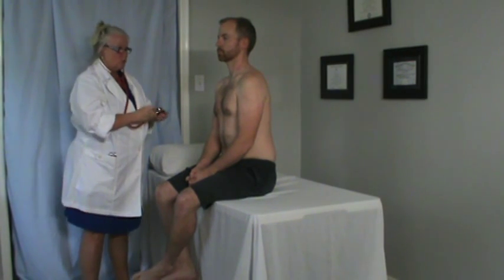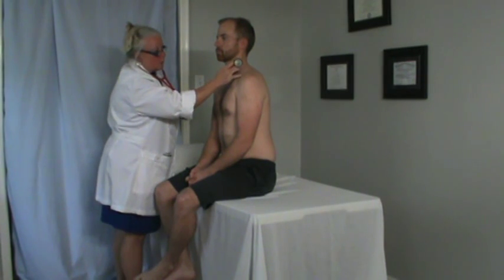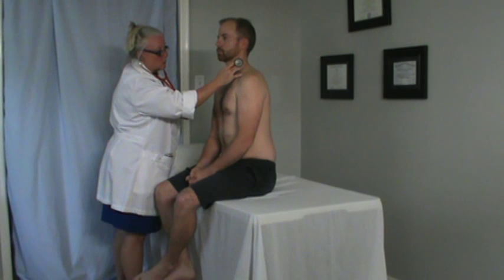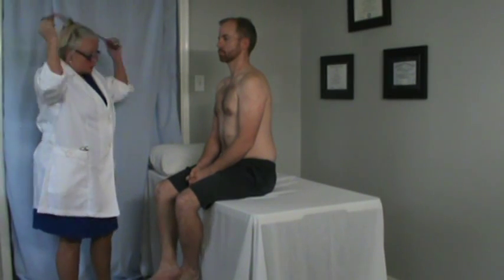The next thing we're going to do is auscultate the carotid arteries with the bell of my stethoscope. Hold your breath for a moment, Chris. Breathe. Hold your breath. Breathe. And then auscultating the thyroid. You're listening for any extra sounds such as a bruit. And none were heard.